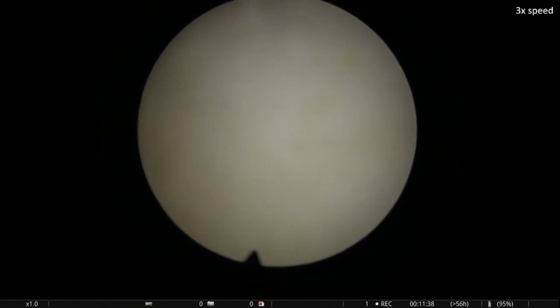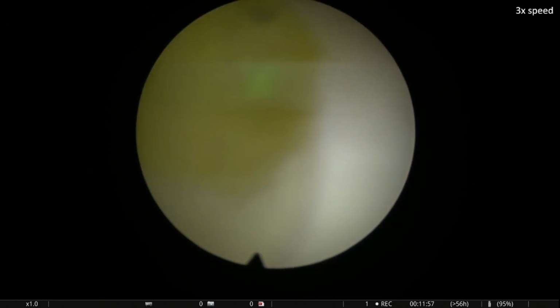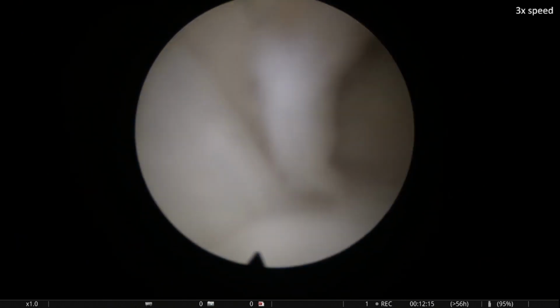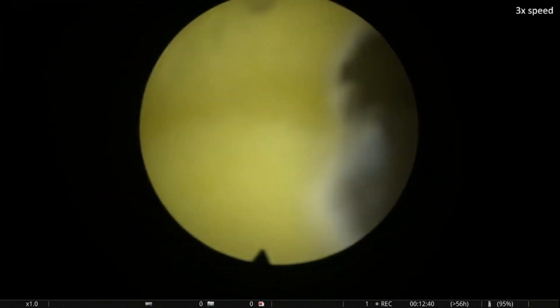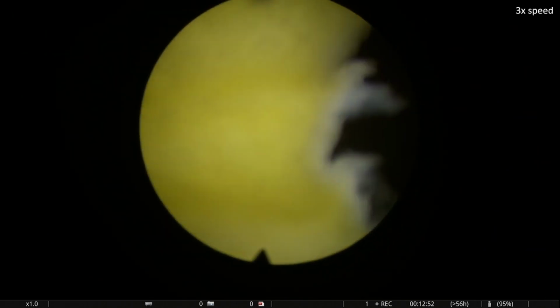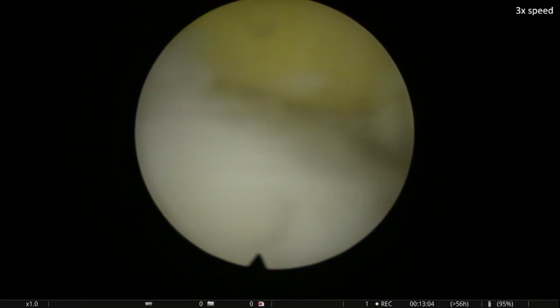As with the median lobe, the planes developed to remove the lateral lobes can be easily identified. The adenoma will not separate easily from the capsule with blunt dissection, encouraging trainees to identify and develop planes using the laser. Because the pubic bone in the frame is 3D printed with a rubber-like material, trainees can feel the anatomic limits of their scope movements while enucleating the most lateral portions of the prostate without potentially damaging the scope on a hard boundary. This model has been tested and works with either holmium or thulium laser fibers.